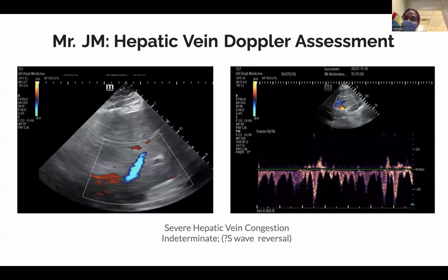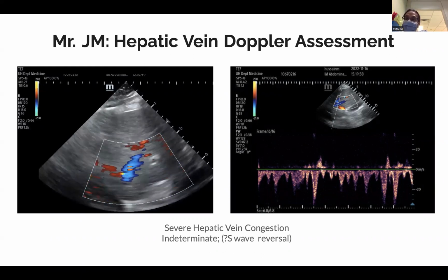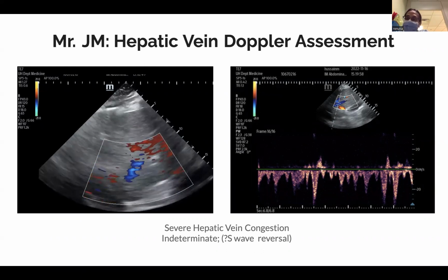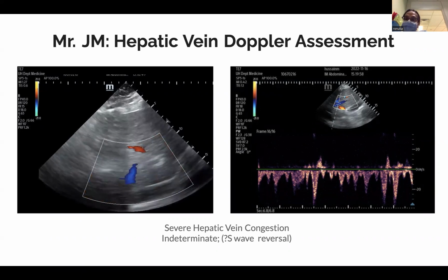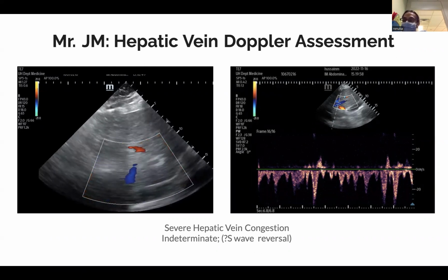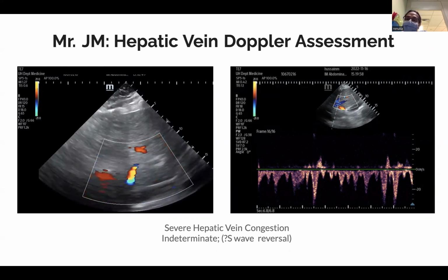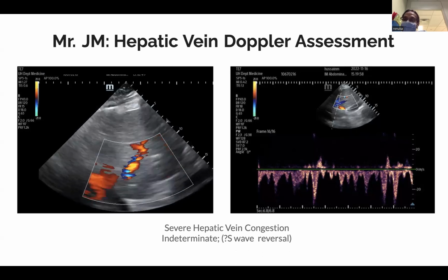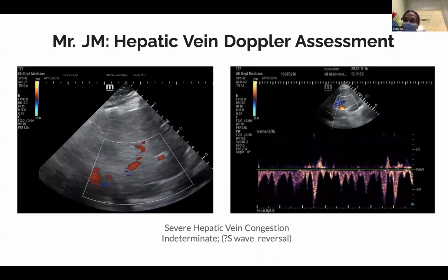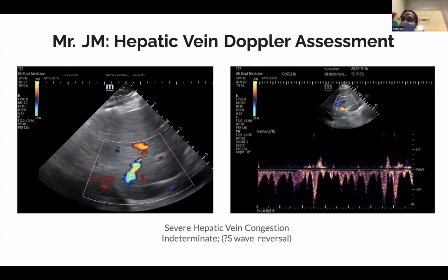Every time I noticed that the hepatic vein Doppler was interrogated, it was almost not parallel, and the pulse was kind of 60 degrees to perpendicular. So that was also one of the things you'll have to try your best to improve the image such that you find the vein blood flow more parallel to your interrogation, because every time I noticed it was almost kind of perpendicular.